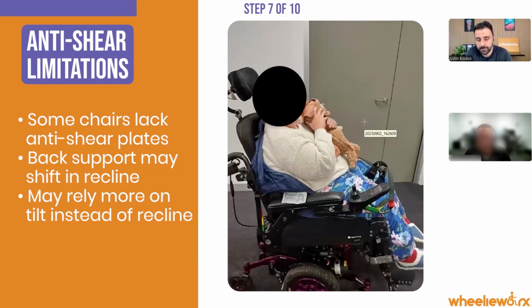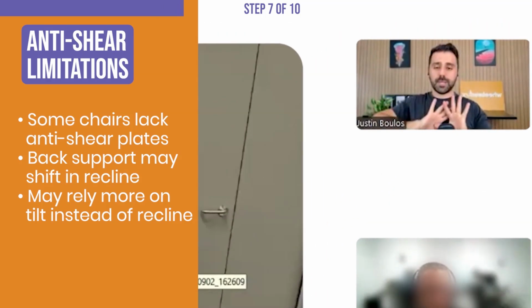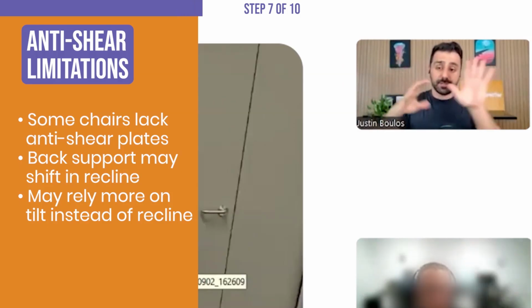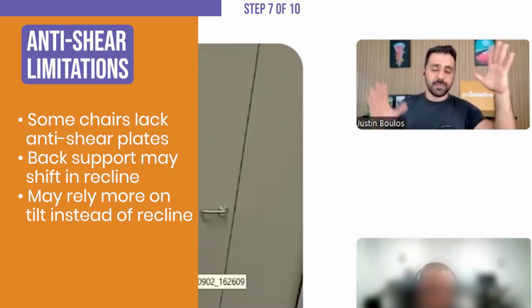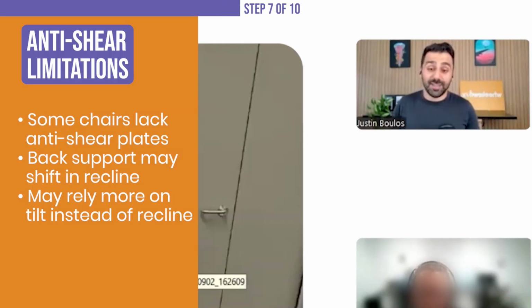It's a hard situation because even if you do go with a backrest with the power anti-shear plate, like Permobil or Quantum, they don't have back canes. They have a central spine plate. So it's harder to fit the gluteal shelf underneath the backrest because there's something there now. So then you have to make the backrest thicker, and when you make the backrest thicker, that also messes up the pivot points. And there's no real good solution with bariatric seating; it's a very difficult thing to get.